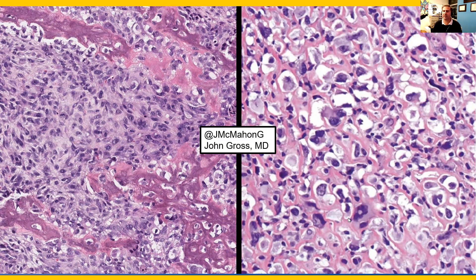At higher power on the right, we have anaplastic tumor cells that are variably pleomorphic, which directly produce this mineralized osteoid matrix, which is very fine, wispy, and lace-like.